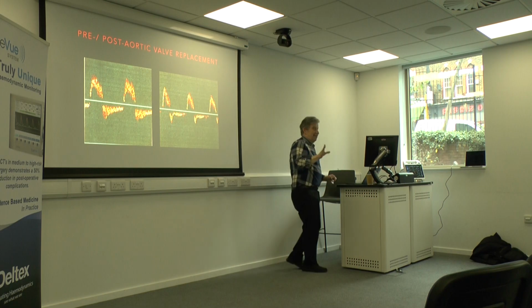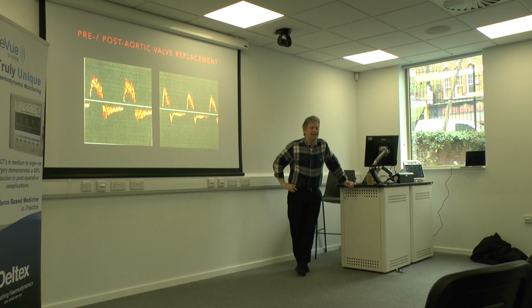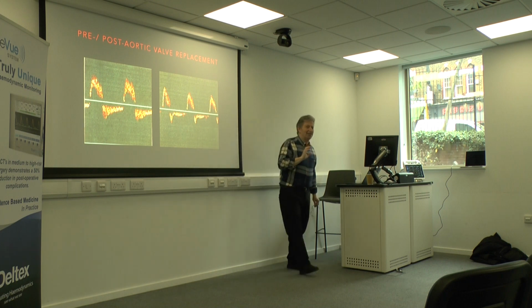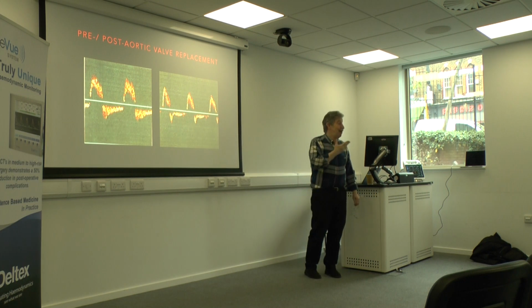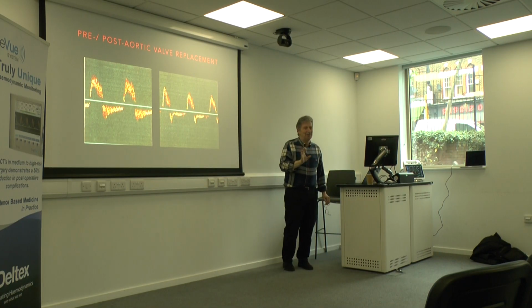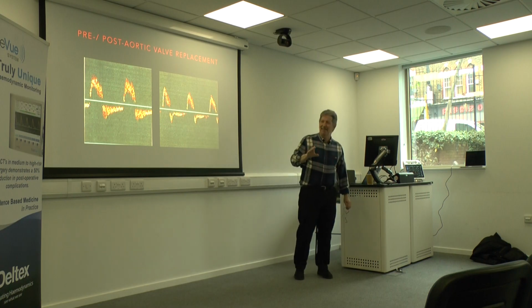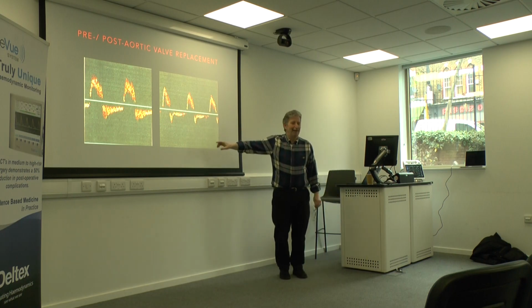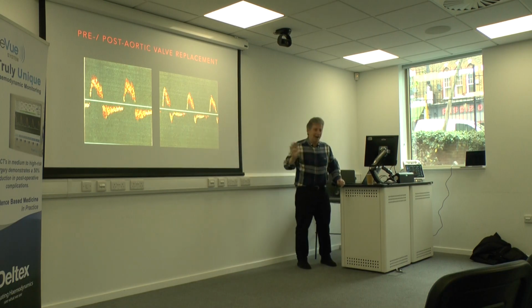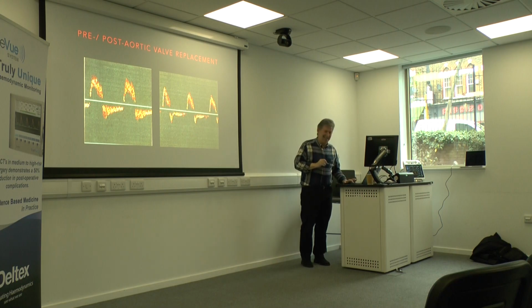And this is in the days before TOEs were being done in cardiac anaesthesia. I thought, this is not the way it should be. Still getting this, and without telling the surgeon, I arranged an unofficial echo, which confirmed he had a paraprosthetic leak. And then I told the surgeon, actually. And he said, but it's better than it was, so I'm happy. Well, I think fine. And so every time after that, when he was changing things, he said, does it look all right? Yeah, fine, amazing. So he did take it on board.